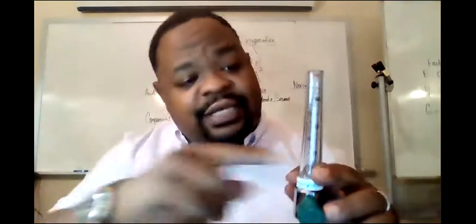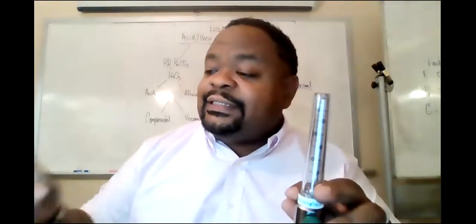So it is accurate at all times. So I thought it was on 6 liters, but since it says 2 liters, well, it's supposed to be on 6. Why is that? Because it's kinked, right? It is being occluded somewhere and it has dropped the pressure down. And so now it's letting you know it is accurate. It's telling you what he's really getting. You thought he was getting 6, but he's only getting 2 because it is kinked, because it is a compensated Thorpe tube. That's what we want.